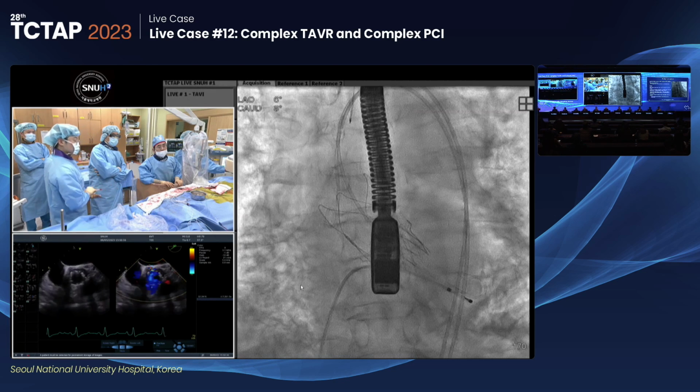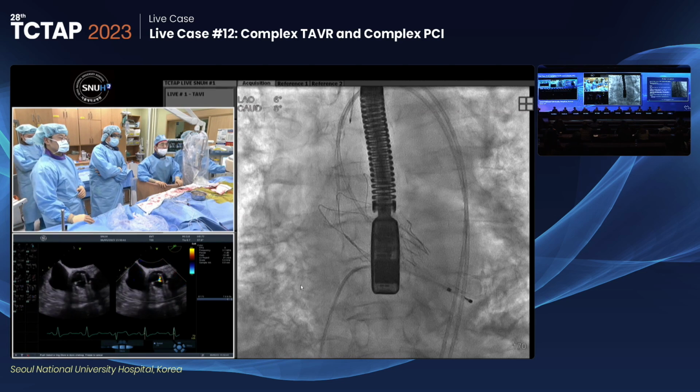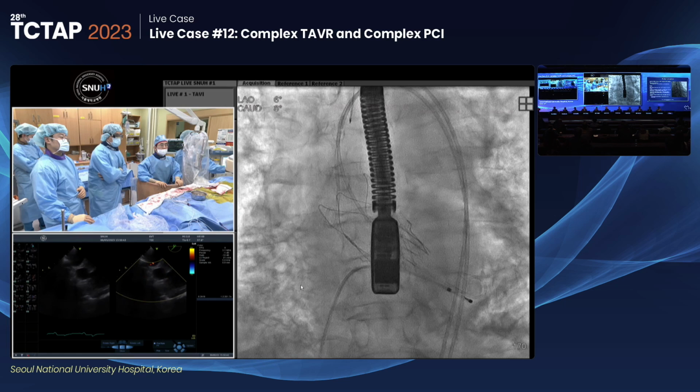Okay, longitudinal. Yeah, but I think there's also some degree of outside. Yeah, on the left, sure.